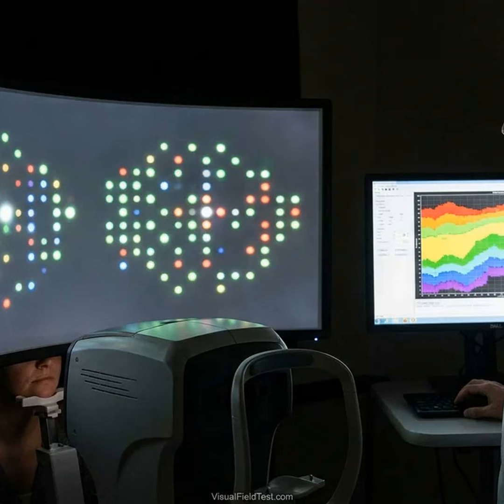Incorporating color and contrast perimetry alongside structural OCT/OCTA offers a multimodal approach. For patients, this means problems might be detected by tests of color or flicker vision, even if standard vision still seems normal. For clinicians, the challenge is selecting the right test for each case and managing the added testing time. By following protocols that limit fatigue and redundancy, one can gain the specificity of these tests while keeping exams practical.